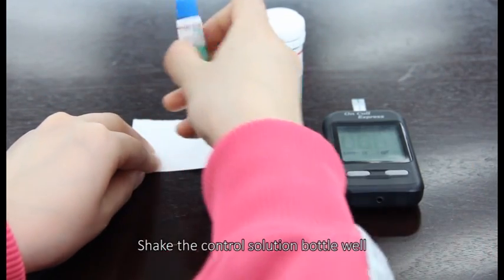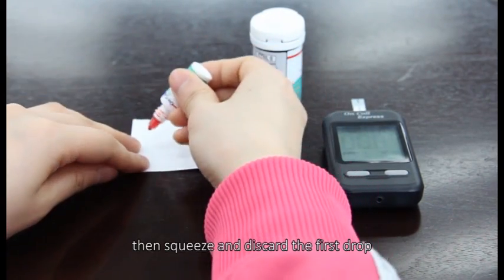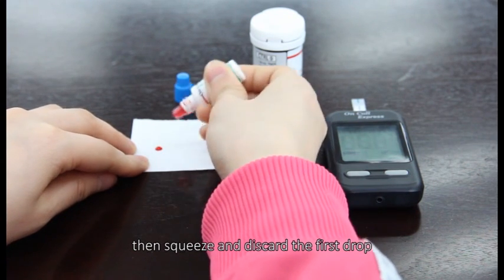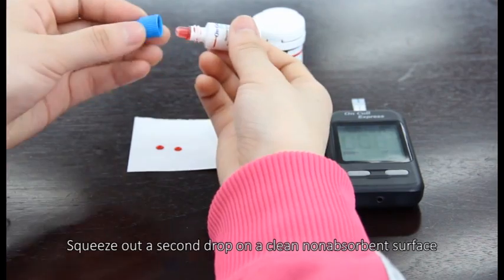Shake the control solution bottle well. Then squeeze and discard the first drop. Squeeze out a second drop on a clean, non-absorbent surface.